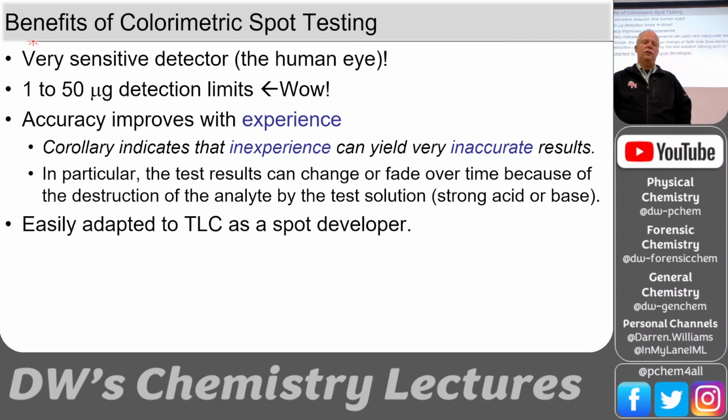So as we talked about with thin layer chromatography, you get separation in your spots, but a lot of times the organic compounds just look kind of yellowish, right? You've got white light hitting it, but some of the functional groups are absorbing the UV and a little bit of the blue, and that's enough to give it a slightly yellow color. I don't know if you have any memory of childhood where you've got something in the window and it fades and yellows.